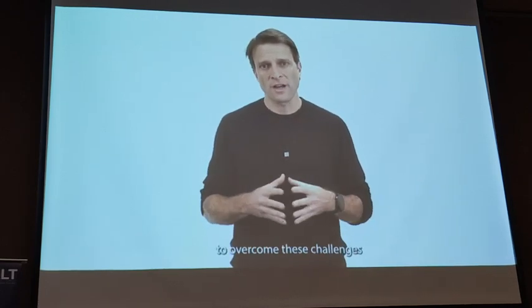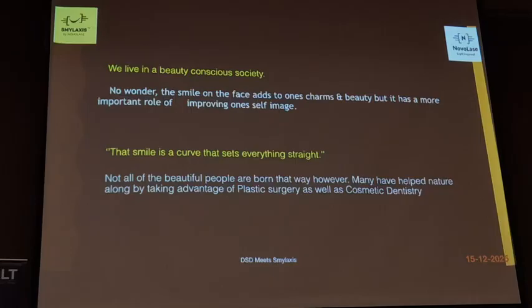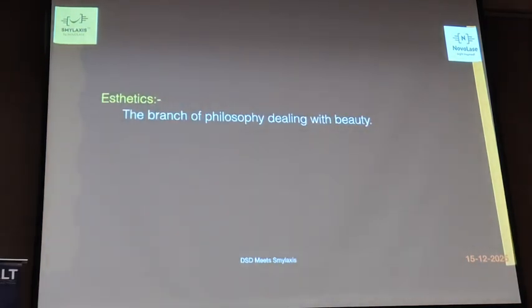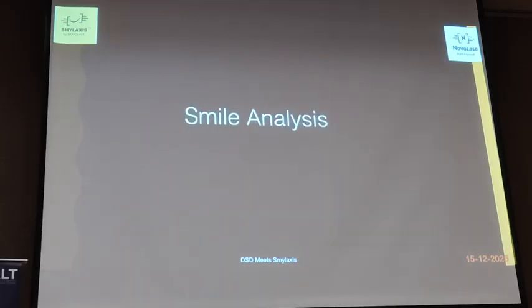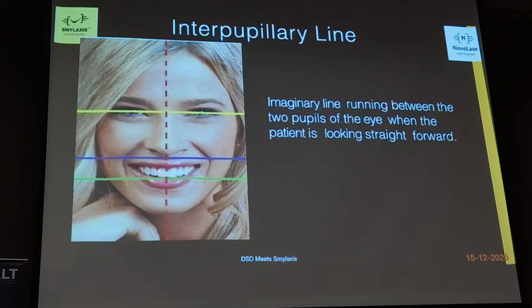I'll just show you what are the basic landmarks of his proposal. The modern dentist, will not waste time in this theory part. Yeah, you need to analyze the smile. When you send us the picture like this, a 2D image, we need to analyze what is the interpupillary line, what is this midline, and these two horizontal lines. One is for the occlusal plane, one is for the base of the nose.